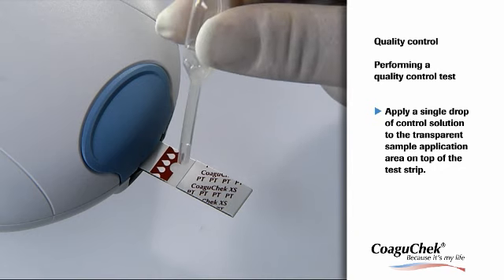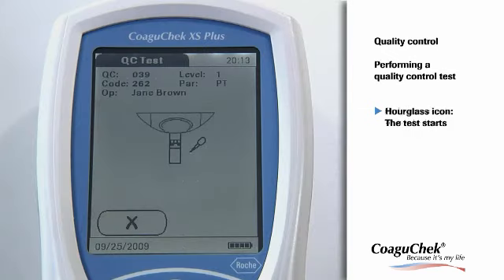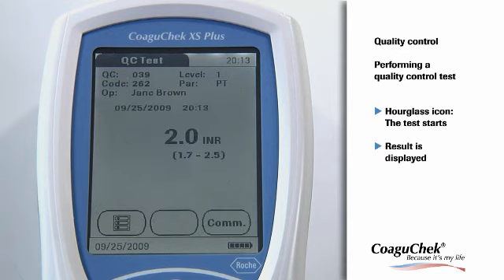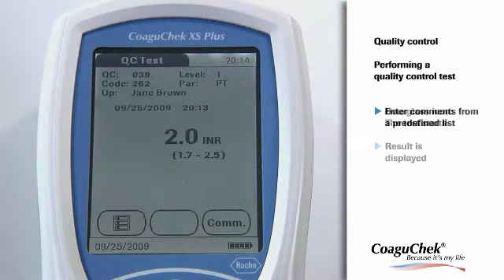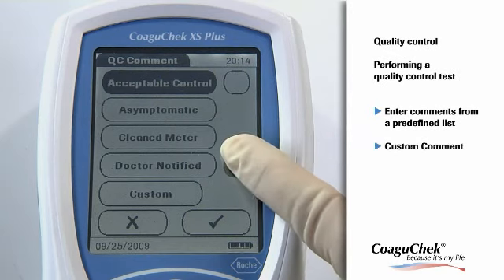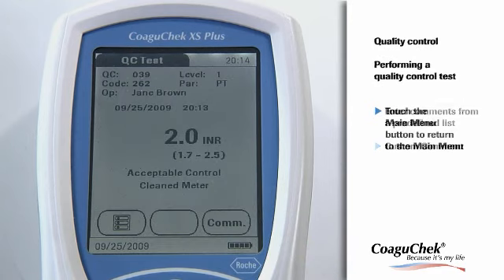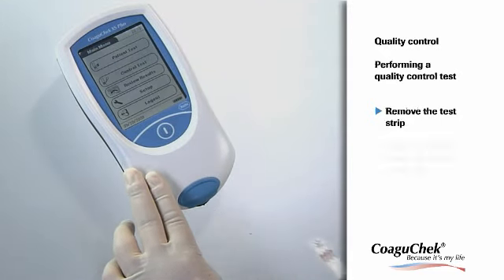Apply a drop of control solution directly from the pipette to the transparent sample application area of the test strip. The pipette icon disappears and the test starts. The result of this quality control test is displayed and it is automatically saved to memory. The quality control range is displayed below the current result. By pressing the comment button on the results screen, you can assign up to three predefined comments to a quality control result. The custom button at the bottom can be used to enter free text of up to 20 characters. You have successfully completed the quality control test and you can now return to the main menu. Then you can remove the test strip and turn the meter off.